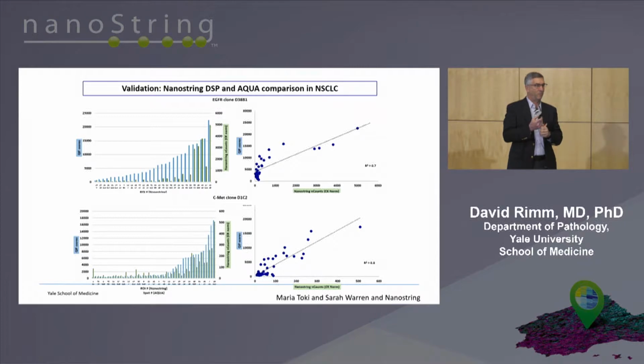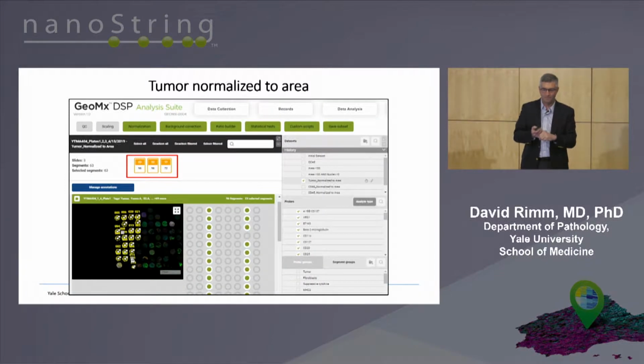And we do know from previous studies that conventional chromogenic immunohistochemistry has a range of about 1 log, and quantitative fluorescence has a range of about 2 logs. And it appears that perhaps the DSP is out at 4 or maybe even 5 logs, which could be very interesting because there is some biology that can't be contained in 2 logs, and especially gene amplification biology.